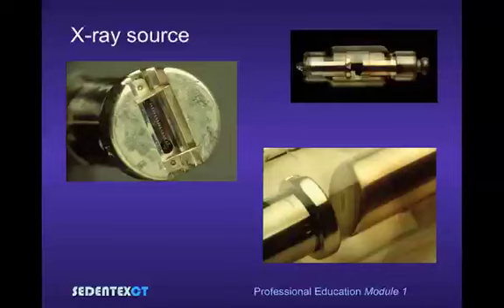At one end is the cathode. Looking at the image on the left, you will see in the center of the cathode a thin wire coil. This is made of tungsten. When the exposure button on an X-ray set is pressed, this heats up and gives off electrons.